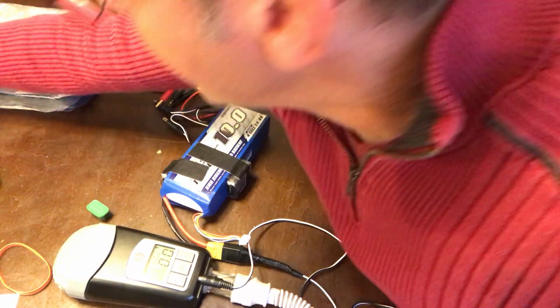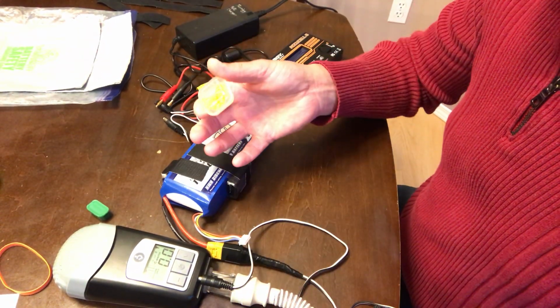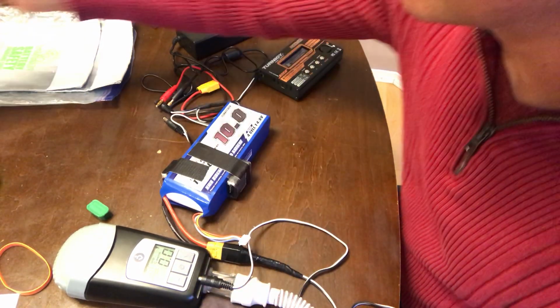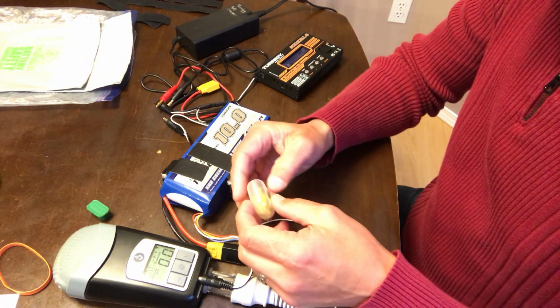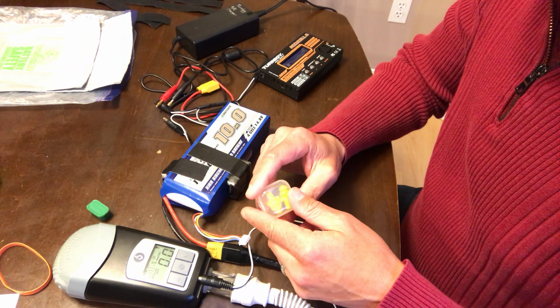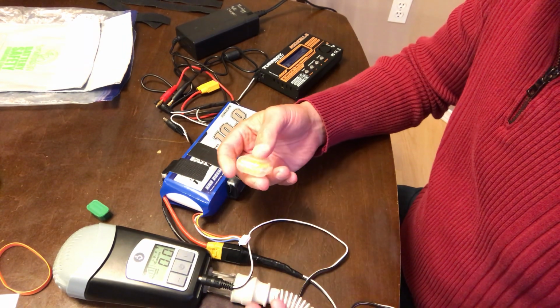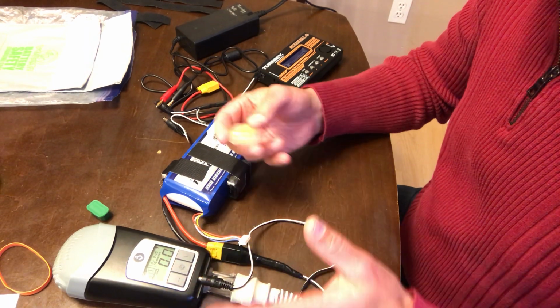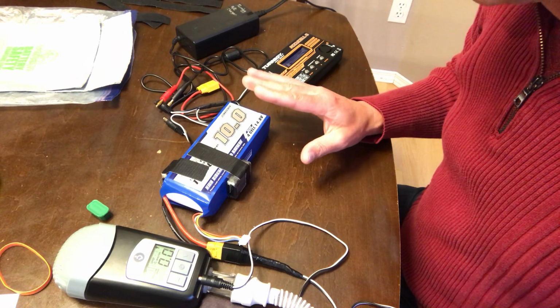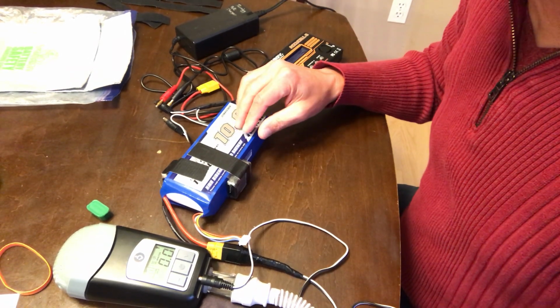that would be great. And then my other recommendation is I always use earplugs because this whole device is loud, and I would use an eye mask because there was light at weird times. So I also would recommend that you talk to your flatmates or your roommates or whatever and say, hey, I use a CPAP machine. You're going to hear this slight little engine hum. And nobody gave me any crap for the month that I was out. It is a little bit annoying to some people, but most people were like, oh yeah, it was just like an air conditioner, just noise in the background.